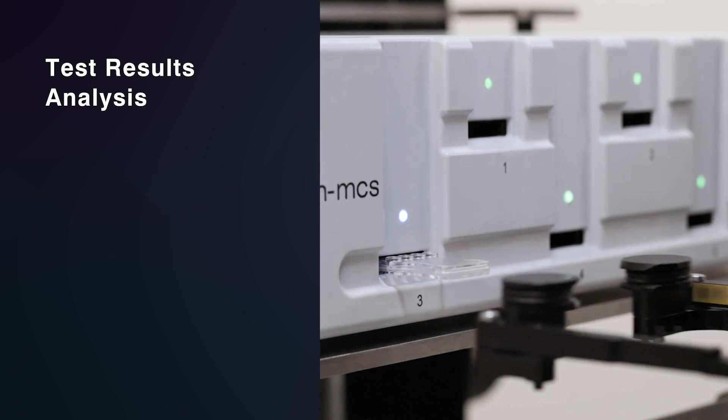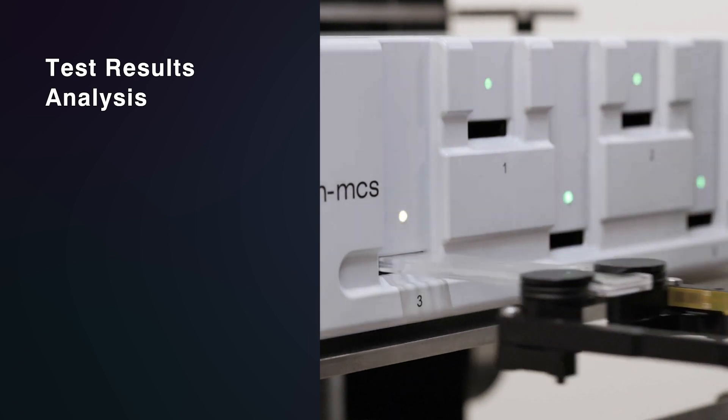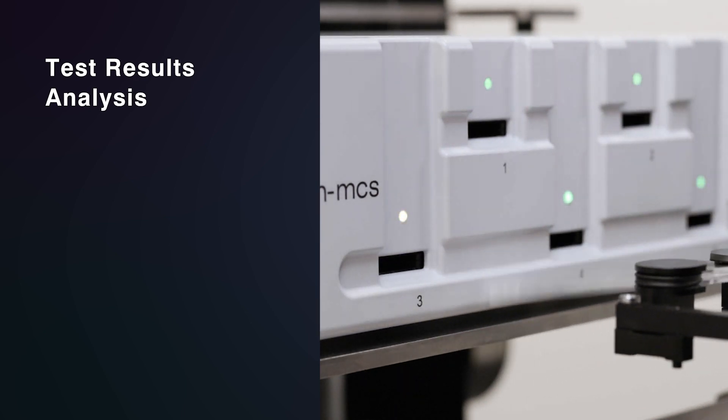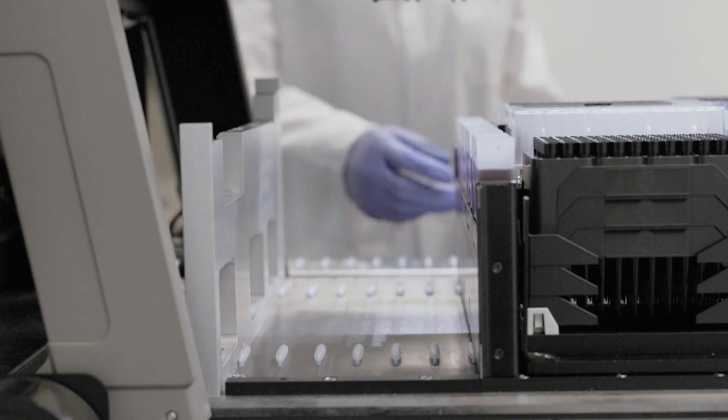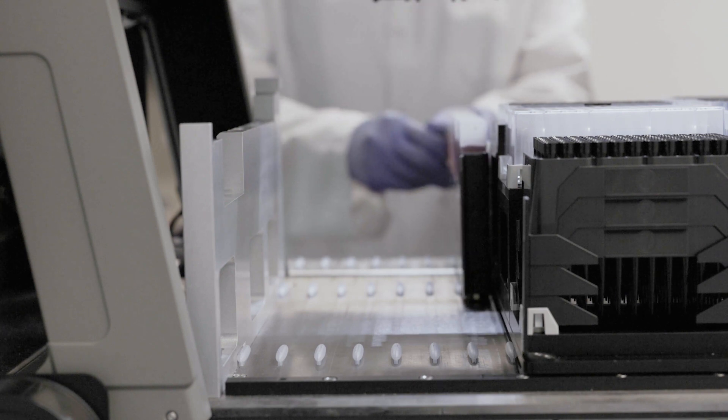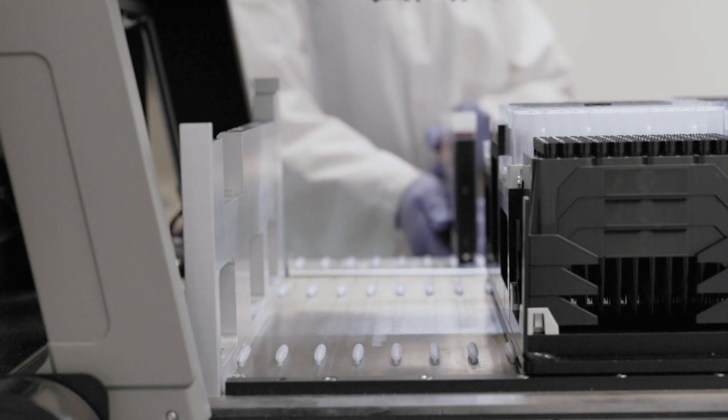When the Nexus 200 has completed testing all the samples, it will remove any remaining cartridges from the NextGen MCS and place them in the waste bin and unlock the door. The user can then safely empty the waste bin and retrieve and discard any accessories that were used during the run.